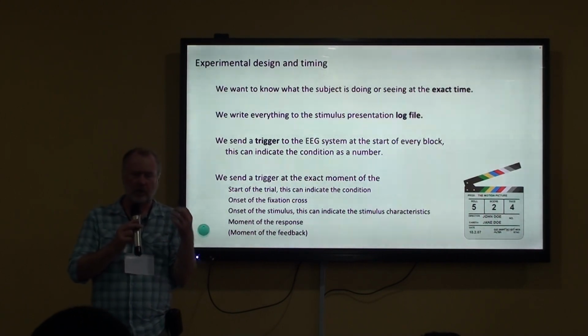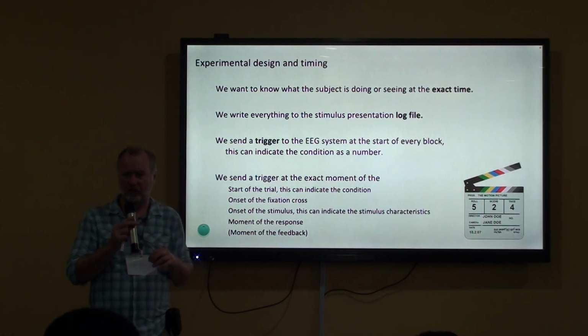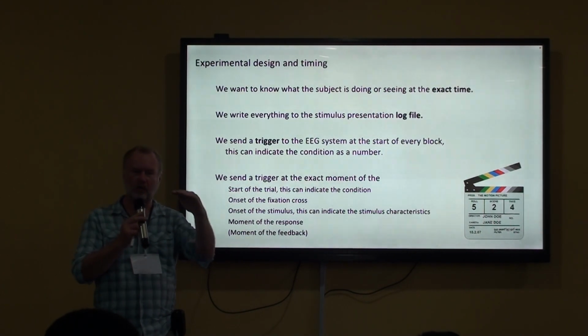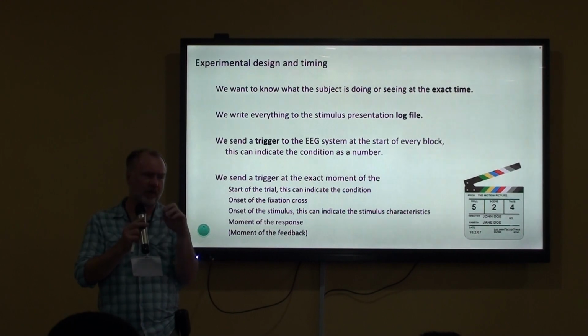So if you look in the event file or in a trigger channel that comes with an EEG system, there's a whole sequence of trigger codes, coding the different elements that we have within a single trial.